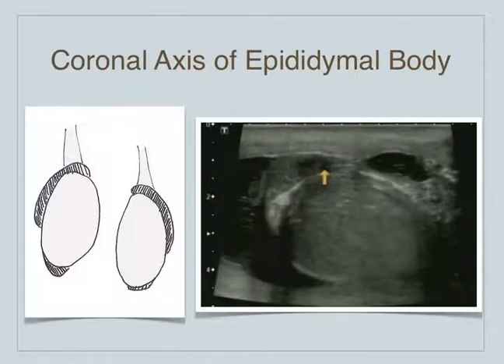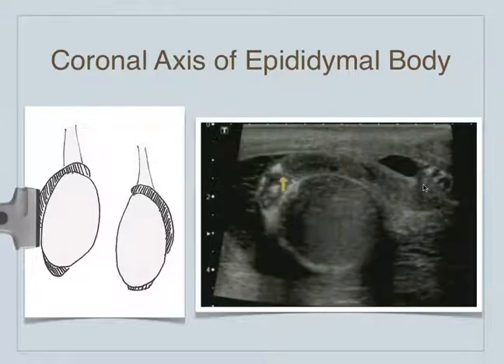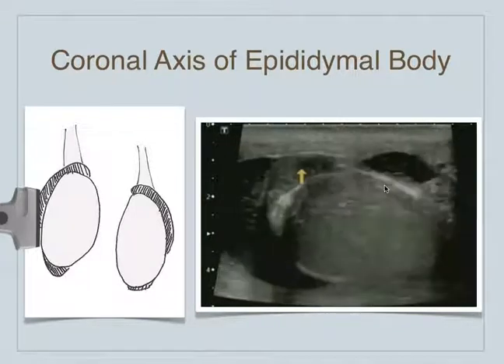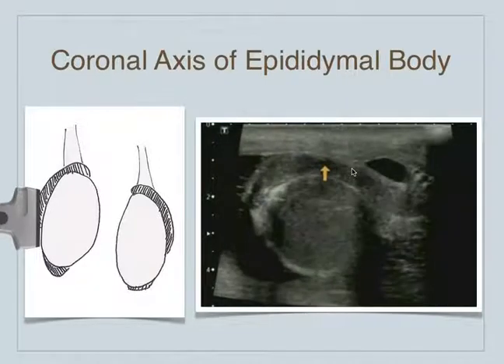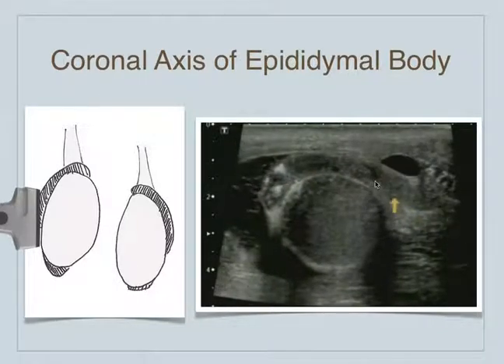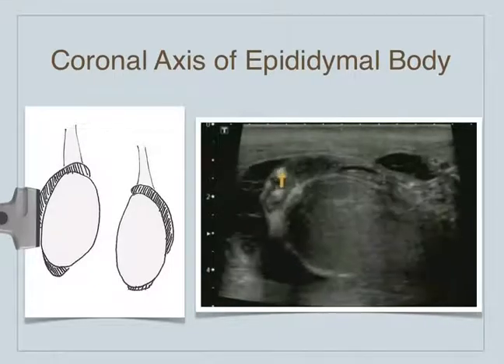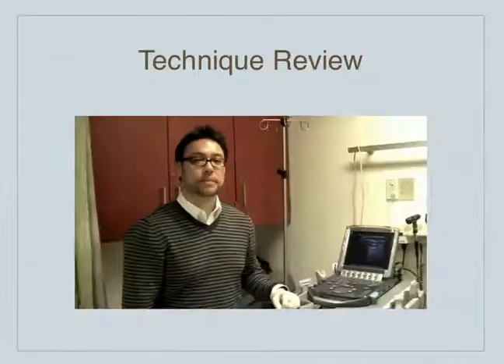Then if we bring the probe to the side of the scrotum, we can make out the coronal axis — basically you see the entire epididymal body here. If you get it just right by moving the transducer all the way to the edge of the scrotum, you can see the epididymis as well as the testicle. It's the only view where you're going to see the epididymis stretch out like that; otherwise on those sagittal views we either saw the epididymal head or the tail.